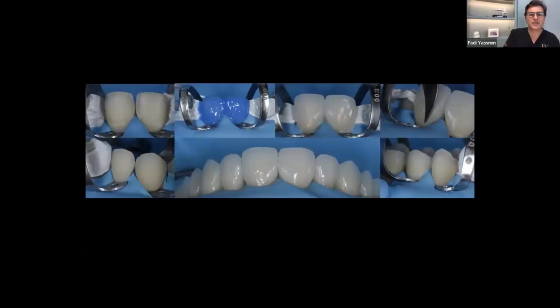With the ceramics nicely polished and glazed, you're able to produce beautiful results, particularly with these multi-layered block ceramics, which mimic the enamel and dentine. A lot of the preparation is quite consistent with the thickness, so as a result, that's built into the actual block as it's milled. And using the natural files of the digital smile design, the texture's already built.